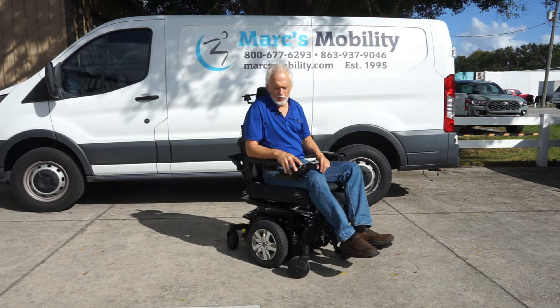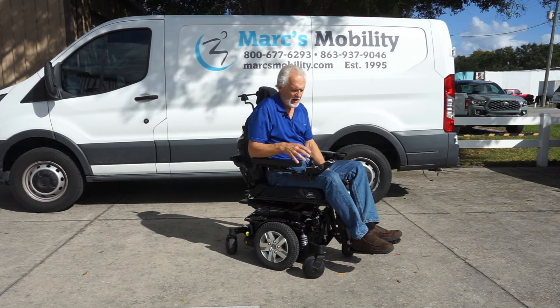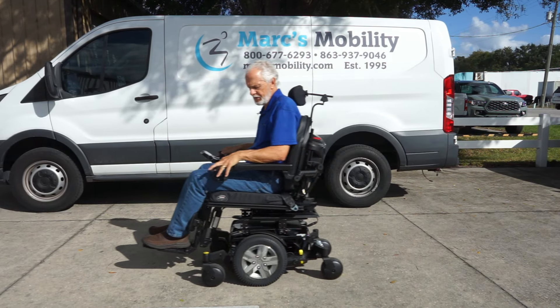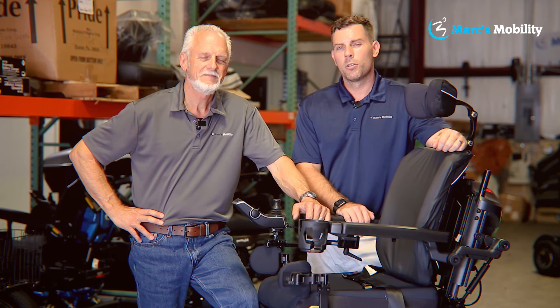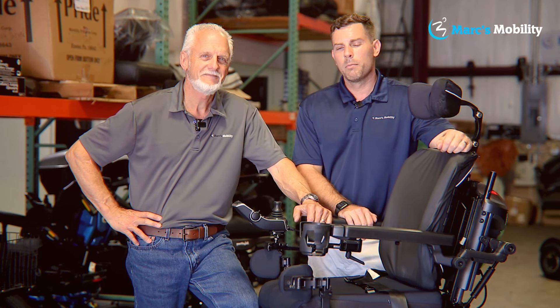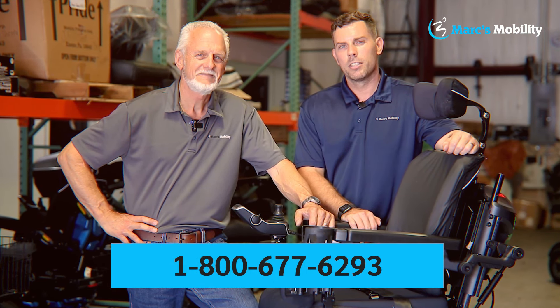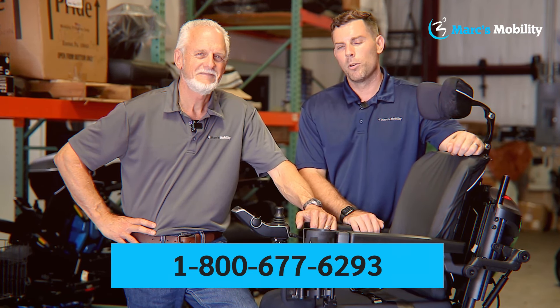If you're looking for a nice chair with electric tilt, electric recline, electric feet, solid tires, black in color, 6.3 miles an hour, used less than a month — this is a nice one. I'm Mark, and my name is Alex — we're co-owners of Mark's Mobility. I started this company in 1995. We sell many products. If you have any questions, call us at 800-677-6293.